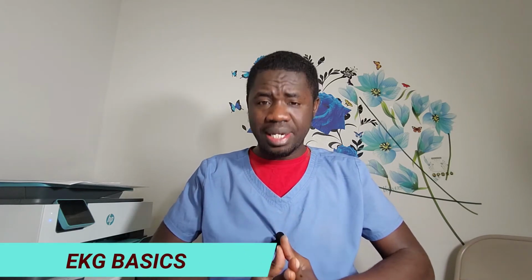So let's now discuss the measurement of waveforms. How did we arrive at those measurements? We said that a PR interval should be between 0.12 second and 0.20 second.